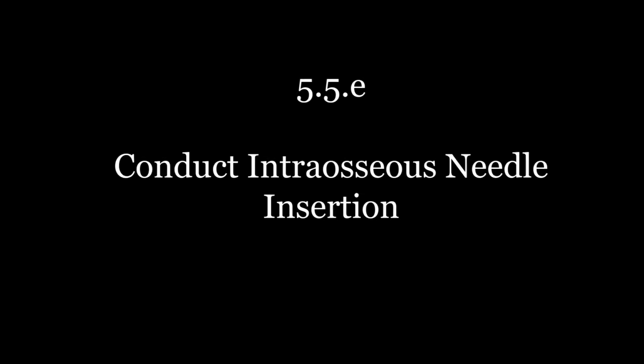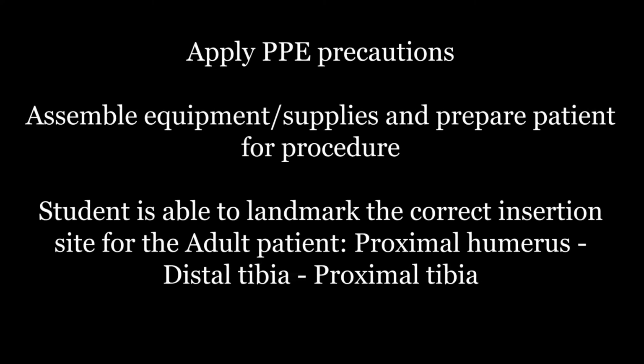5.5e, conduct intraosseous needle insertion. Apply PPE precautions. Assemble equipment, supplies, and prepare patient for procedure.